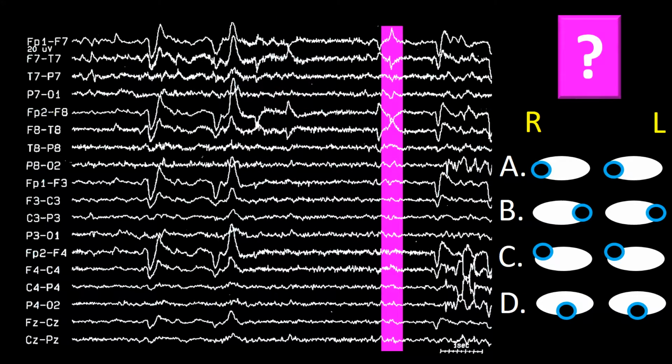Next question. Please take a look at this frame and choose from the 4 possibilities. Try to answer the question without moving to the next frame.